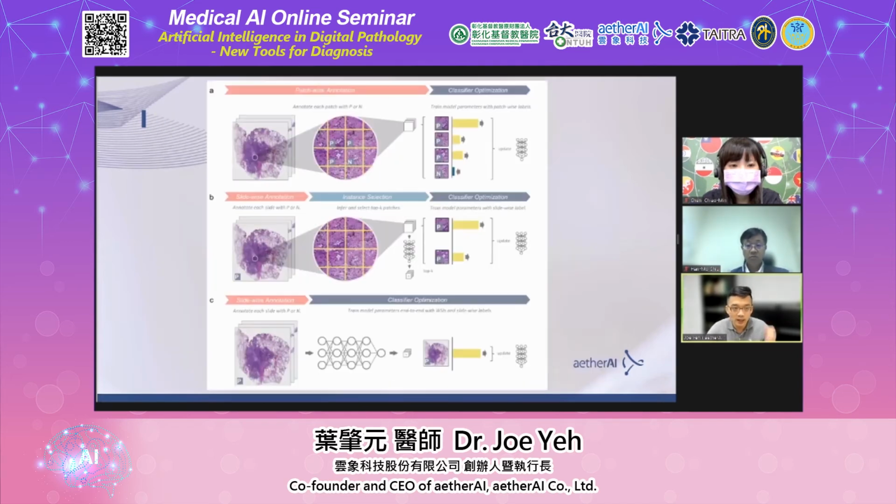for image recognition tasks. Panel A shows the traditional patch-based method where you provide annotation for each image patch. Panel B refers to a weakly supervised method, so-called MIL, without detailed annotation, but using a pre-trained classifier on natural images. Our method, panel C, is a very straightforward method. We train AI directly on images up to 400 million pixels and train it to recognize cancer.